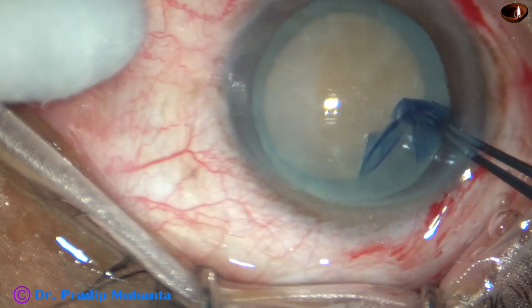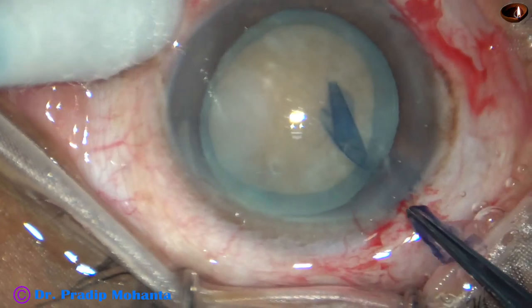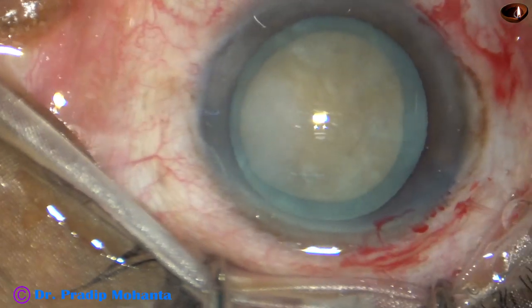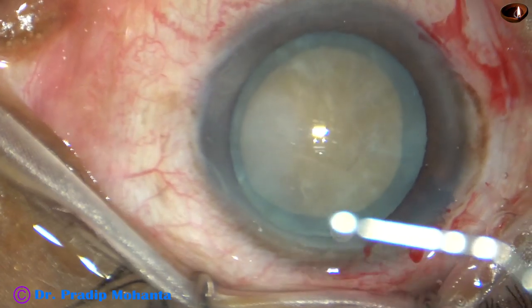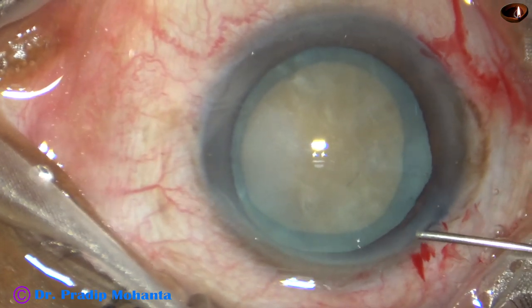The utrata forceps is being used to complete the rhexis. And this is a fairly large rhexis because the nucleus is quite hard, as we are going to see in a short time.